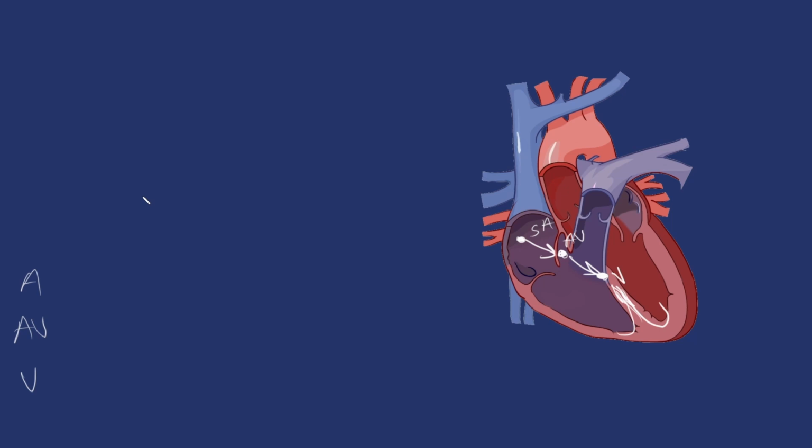All right, and we'll do one last one here before we move on. So we'll draw this out like so. And then it depolarizes, we have a repolarization, and then it goes through. We got these random shapes, so it'll go the same way the whole way through. So we do the same thing. Start with the ventricles. We drop that down. So our ventricles are again depolarizing like normal. Because of that, we also know the AV node here is starting the signal.